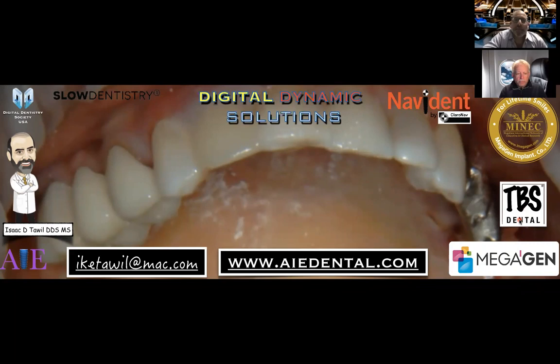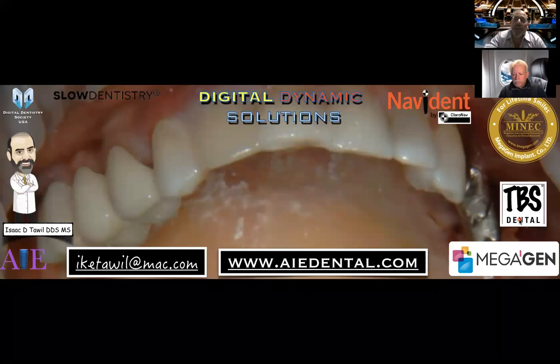I think that's where it becomes the most complicated cases that we have, these curved roots, because you have no idea where we are in the jaw. So if we have a severely curved root and we're trying to access the apex of that root, how are we going to find it? Typically in the past, I would make a 2mm pilot guide that would take me to that apex. But now with dynamic navigation, I can plan basically a miniature implant into that section where the curved root was, and know that I've actually hit that apex to the 1/10 of a millimeter. So having that curved root is no longer an obstacle for me.